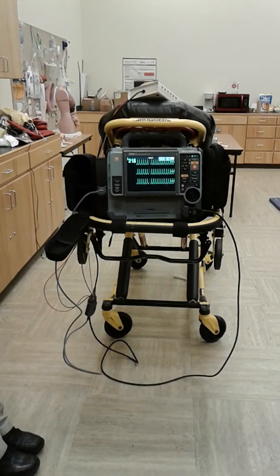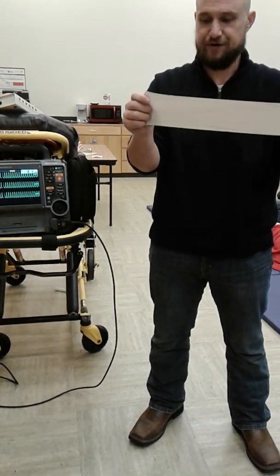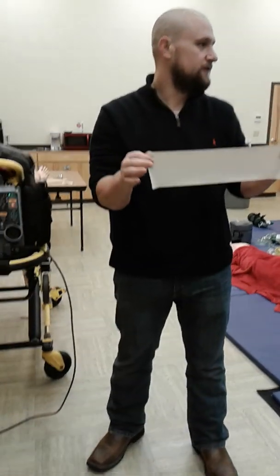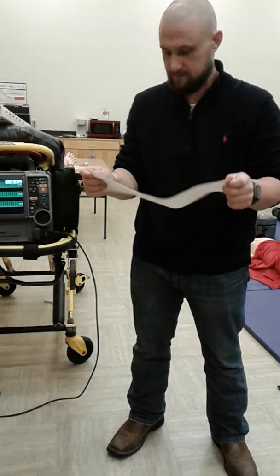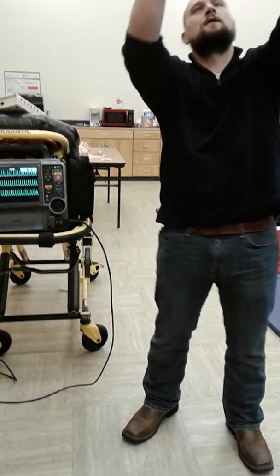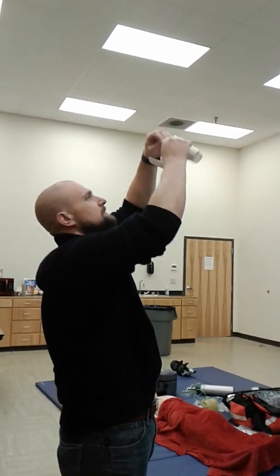All right, now I can look at that and tell it's regular. Again, I've been looking at them for about 2 years now. All right, I can look at them and tell they're regular. If you're unsure, print out a strip, lay it down, mark it out, line them up like that right there.